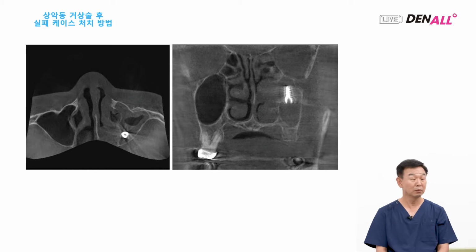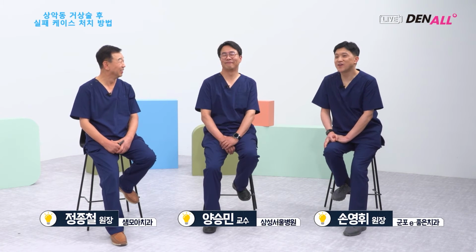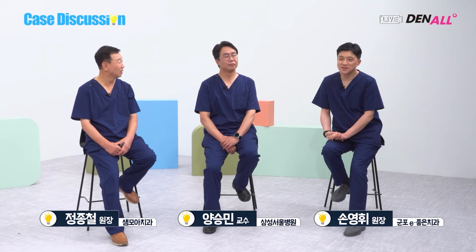Dr. Son, have you removed such implants a lot? Not many, but I have experienced it several times. When the implant fixture is dislocated in the sinus, there are two occasions. If it is dislocated during surgery, it's easier to remove it using suction.